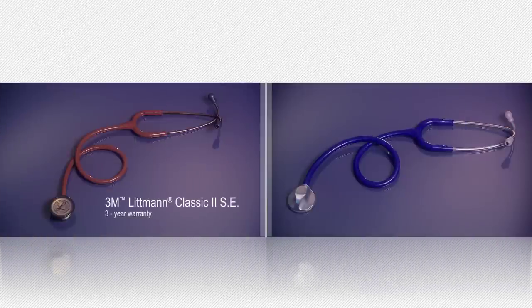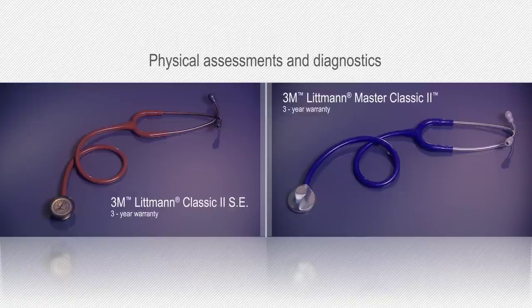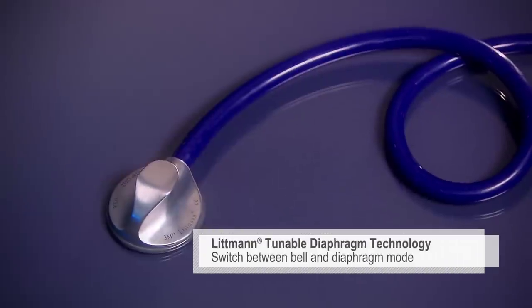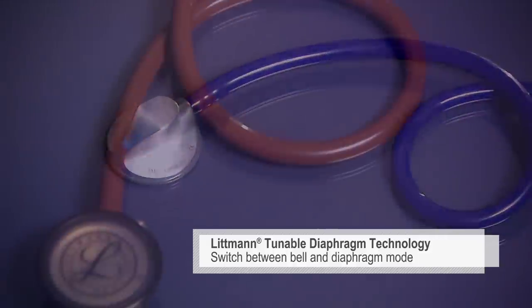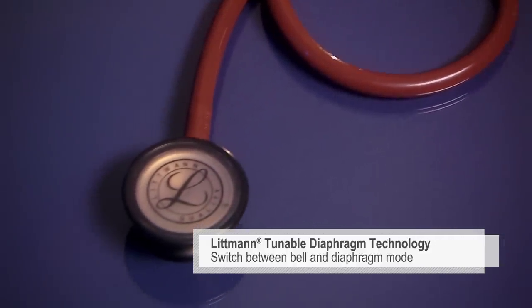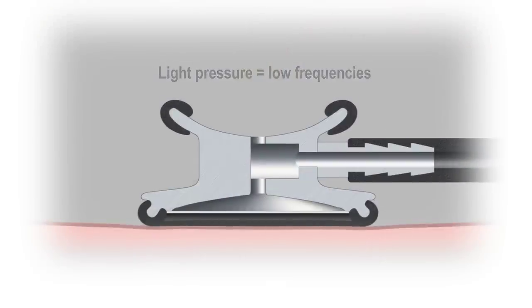The Classic II SE and Master Classic II are designed for physical assessments and diagnostics. Both feature our tunable diaphragm technology that lets you switch between the bell mode for low frequencies and diaphragm mode for high frequencies simply by changing the pressure of the chest piece on the patient.